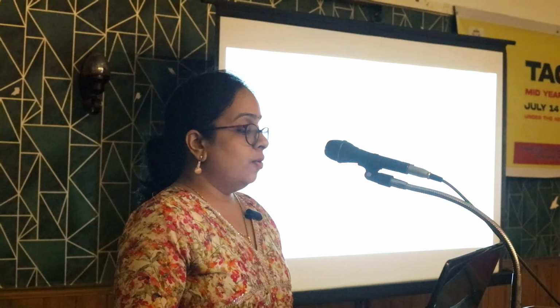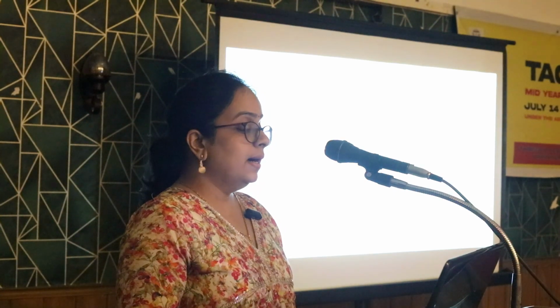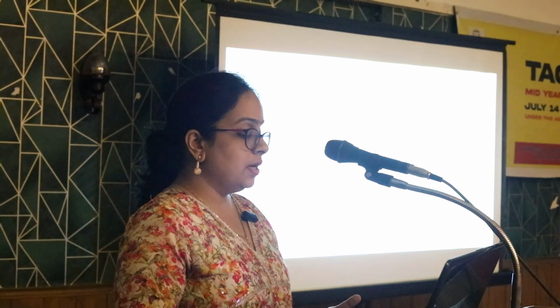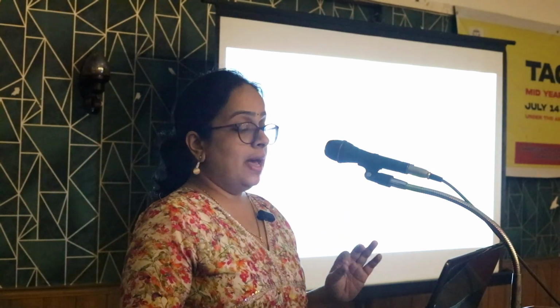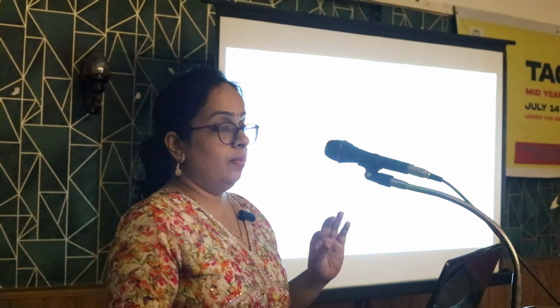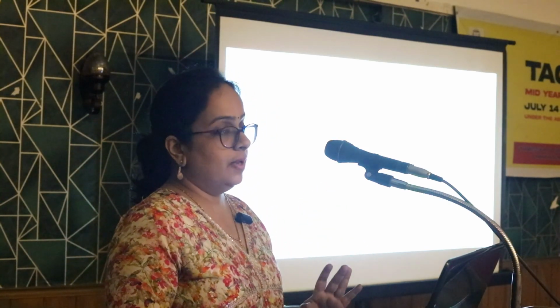So these are the take-home messages. OCT and visual field are complementary diagnostic tools which help in early detection and monitoring, and also in progression assessment to know the rate of progression in each patient. It helps to plan early interventions, but there can be some individual variability, and after all, clinical correlation with other factors is very, very important.